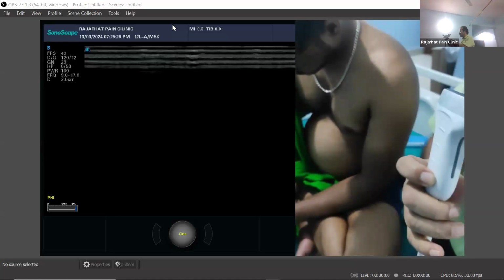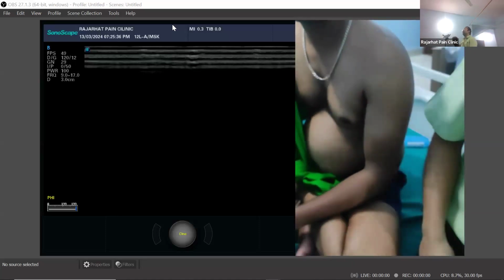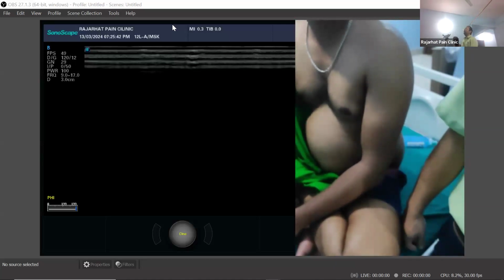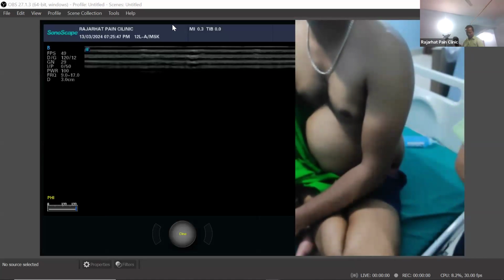Okay, the aspect marker is this much. The picture is a simple rectangular one. If I do not say which side is lateral and which side is medial, many times you will not be able to understand it. That's why an aspect marker is needed.